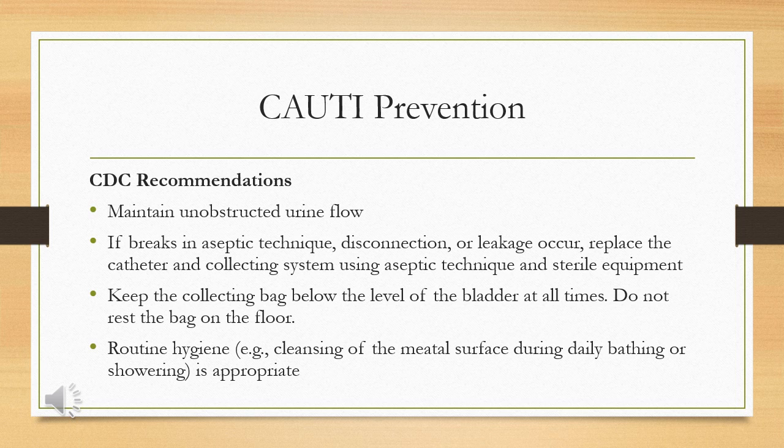So maintain unobstructed urine flow. That's what I talked about with Foley maintenance. Making sure that there are no dependent loops, making sure there are no kinks, and that the urine is flowing. Those are the things you will monitor for when a patient has a urinary catheter.